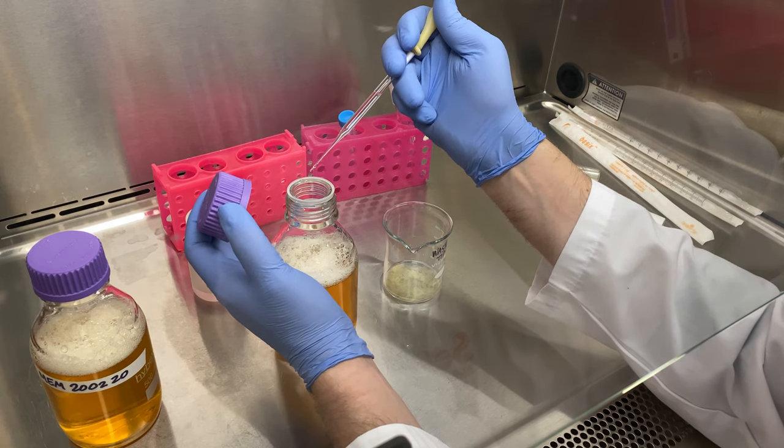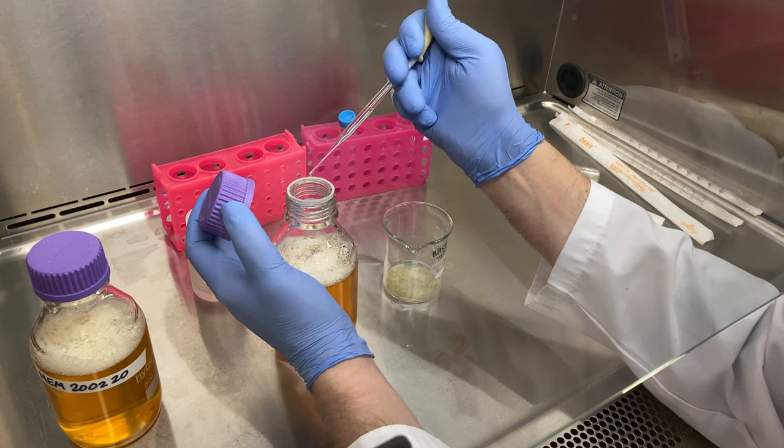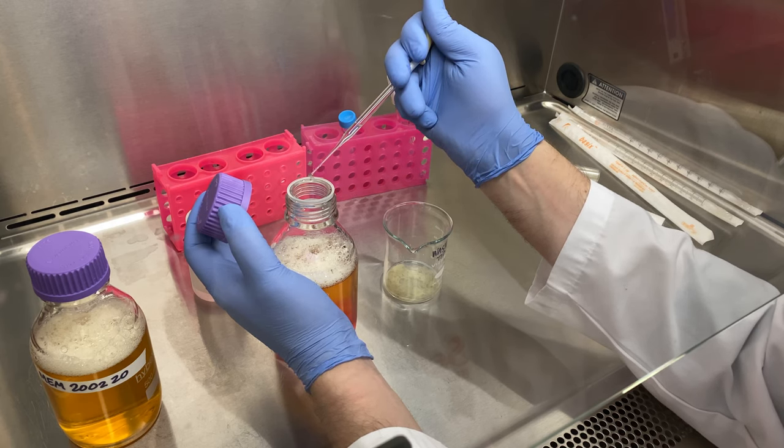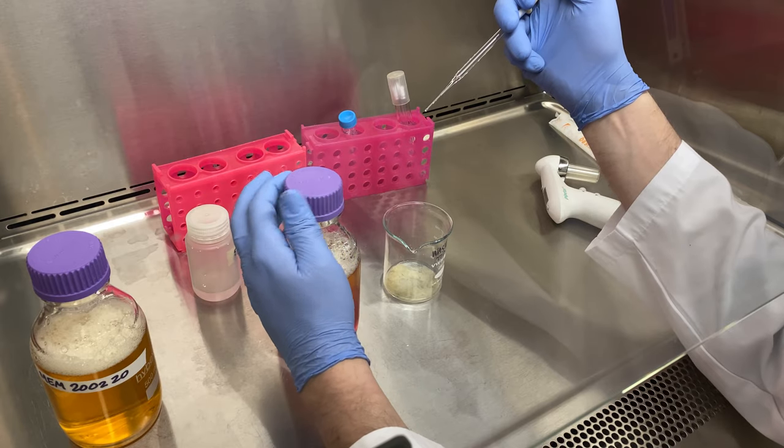To start with, I usually add 20 drops right off the bat — and I ended up adding 40 drops total to the first bottle.